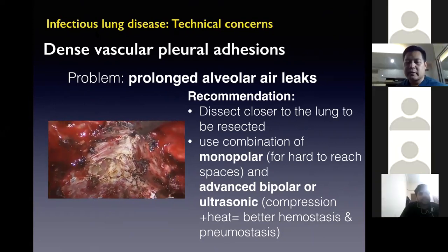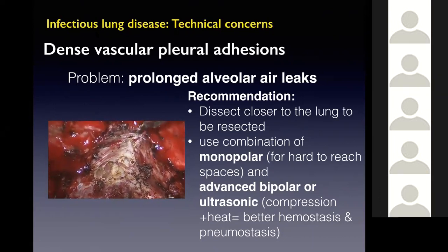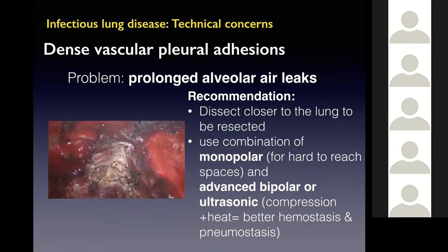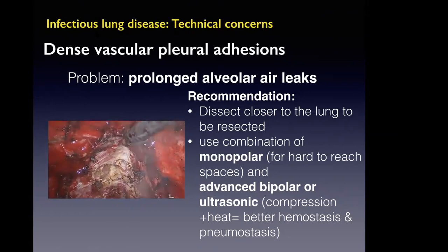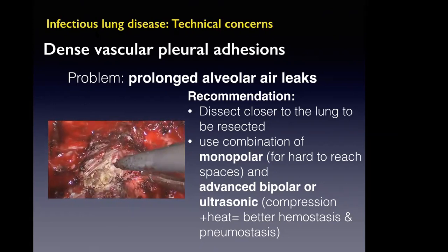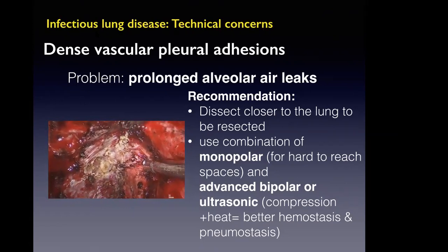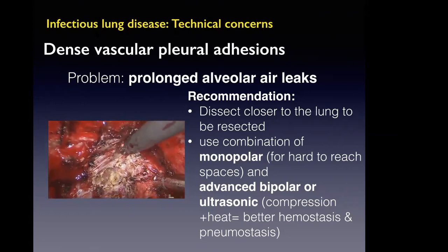So this is an example of that dense adhesions. Yeah, remember, Dr. Khan, when you went to the lung center, we did one case of aspergilloma. Yeah, that's right. I had the airport, so I don't know what happened afterwards. I continued the operation. The patient did well. Yeah.